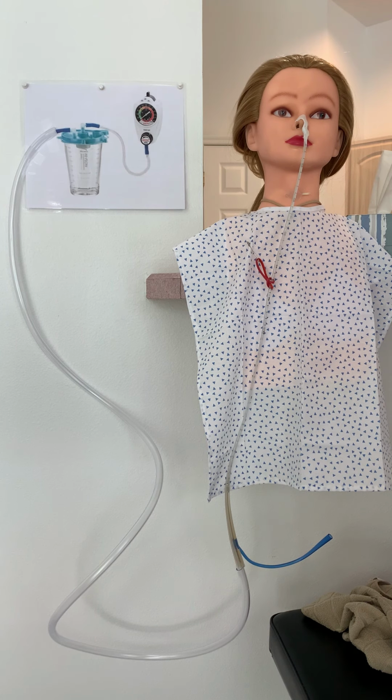So to remove this tube, I'm just going to have you take a deep breath, and I will just pull it out. It comes out real easily. So I'm going to go ahead and raise the bed up to a comfortable level and make sure you're on a 45-degree angle. I'll put the side rail down on my side of the bed, make sure it's up on the other side.